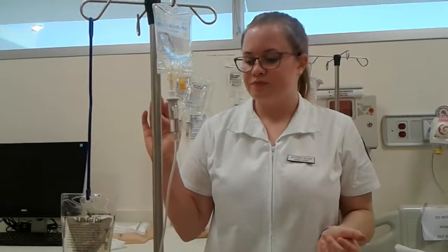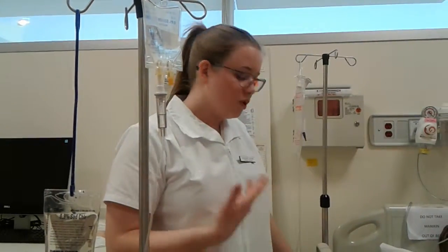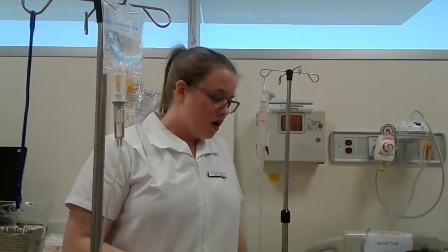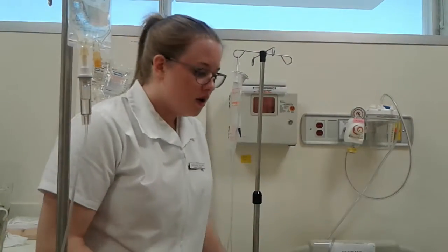I would then document all of my observations throughout the procedure along with my I's and O's and make notes on the medication record. I would also reassess my patient for comfort and how they tolerated the medication. Before I leave, I would need to lower the bed all the way down and give the patient their call bell. I would need to wash my hands, and that's all.